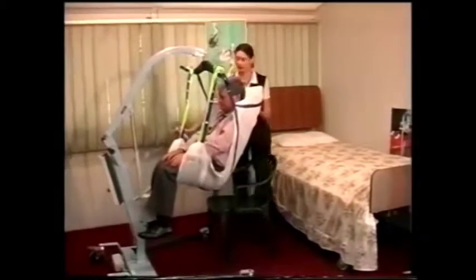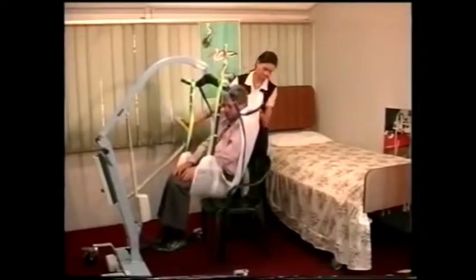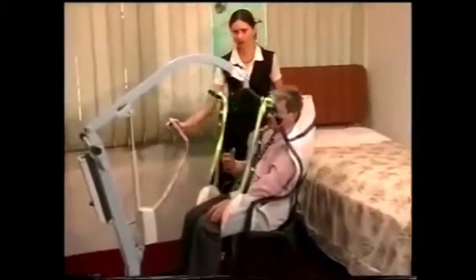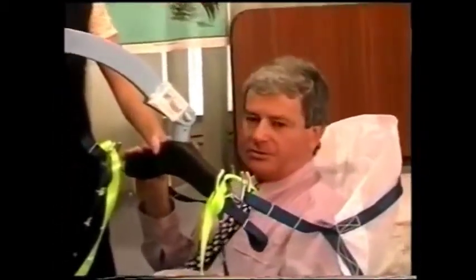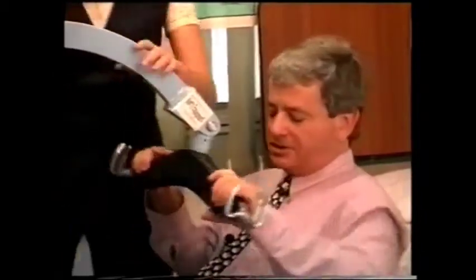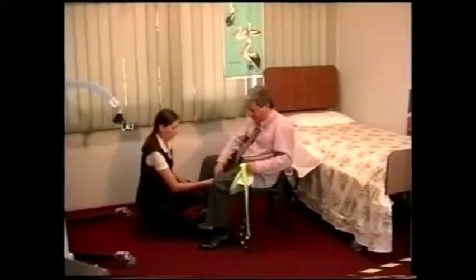Very popular with double amputees because of the padding under the legs. Did you notice then how the hoist moved in? One of the things I like doing is leaving the brakes off on a hoist. Can you stop it? By leaving the brakes off, it means that you can very easily move it out of the way after you lower the patient down, and less chance of the nurses or the patient damaging themselves against the hoist. There are two schools of thought about this.